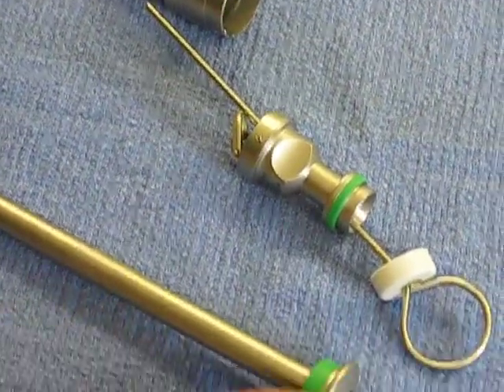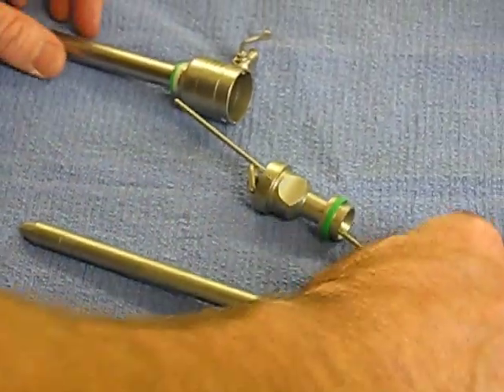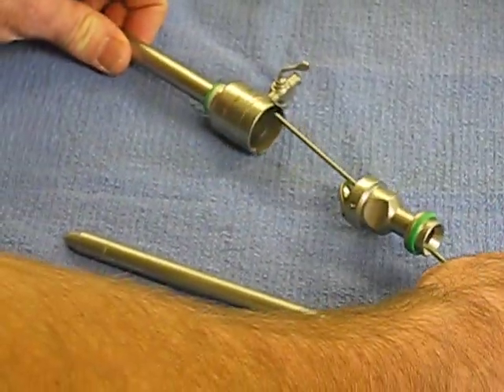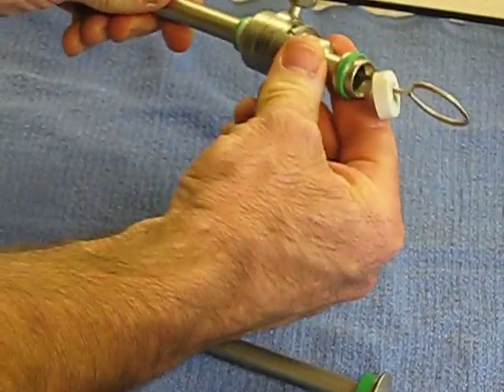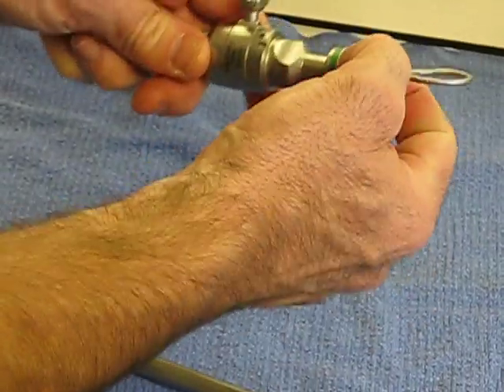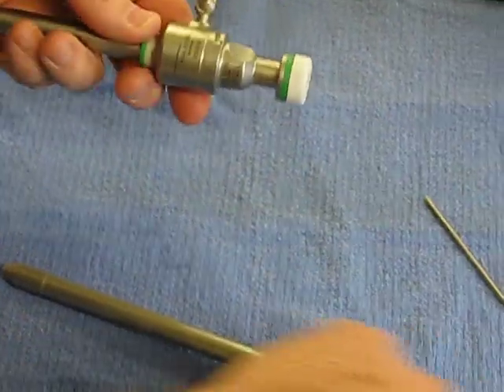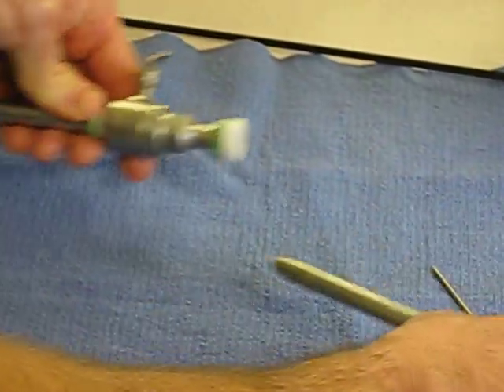What you want to do is sterilize these pieces all separately as shown here. And then when the doctor goes to do the procedure, the pin keeps everything in line so that you can assemble the valve, put the sealing cap back on, and then pull the pin out and it's all ready to go with the trocar inserted.